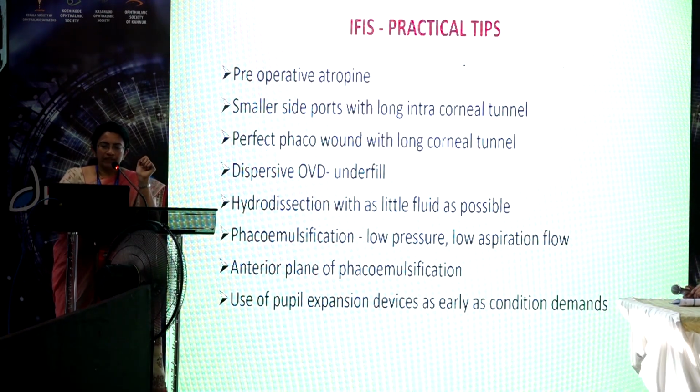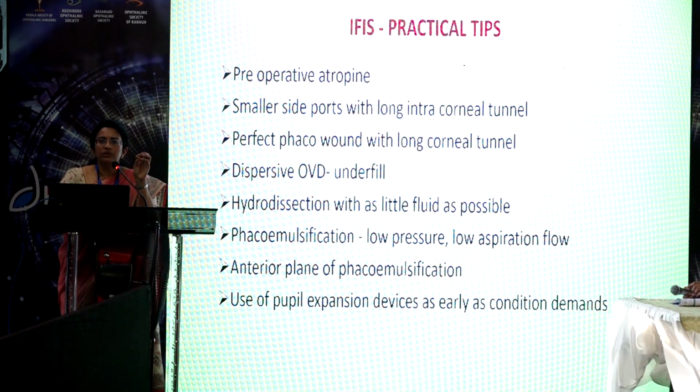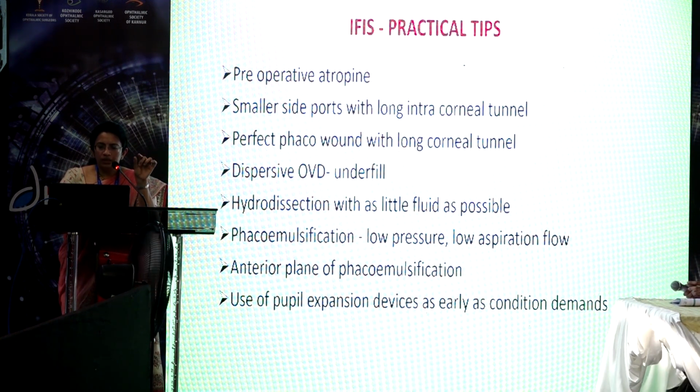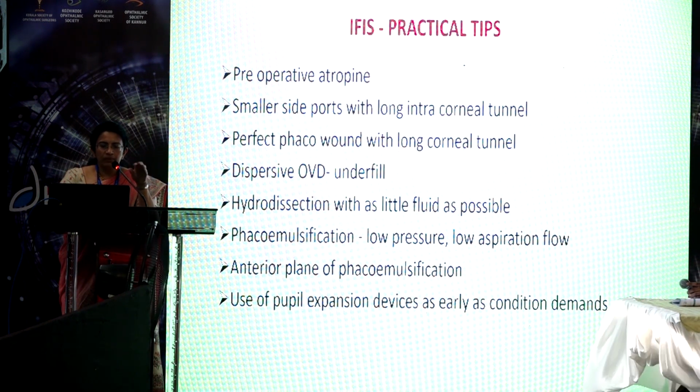Now coming to the practical tips, few things. One is preoperative atropine and NSAID drops are useful in reducing the incidence of intraoperative miosis. And the side ports should be very small and should have a long intracorneal tunnel. And you should have a perfect phaco wound with the long clear corneal tunnels. And you should use dispersive OVD because the iris will behave better with that in the case of IFIS.